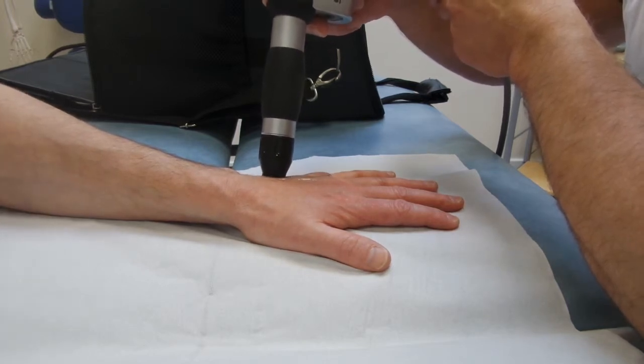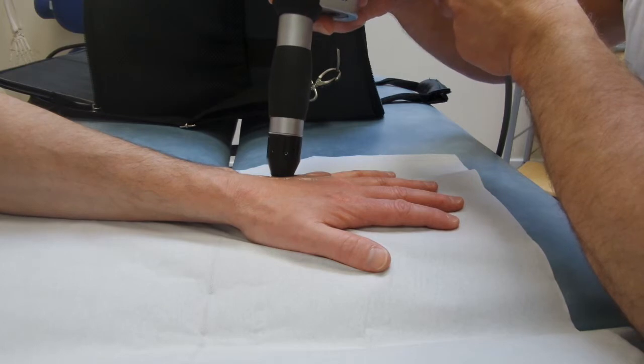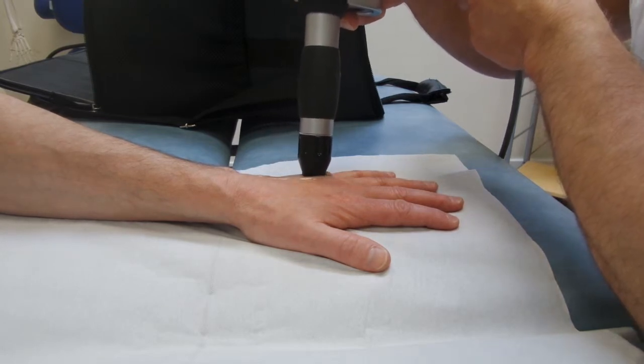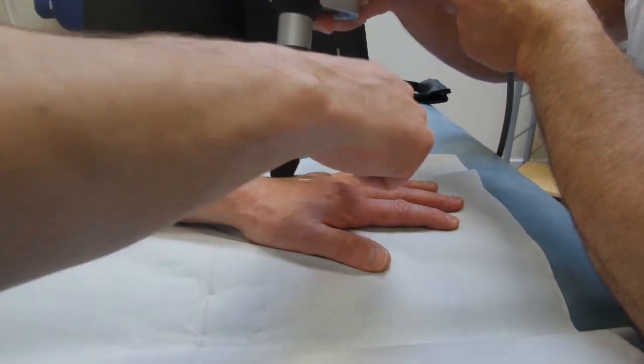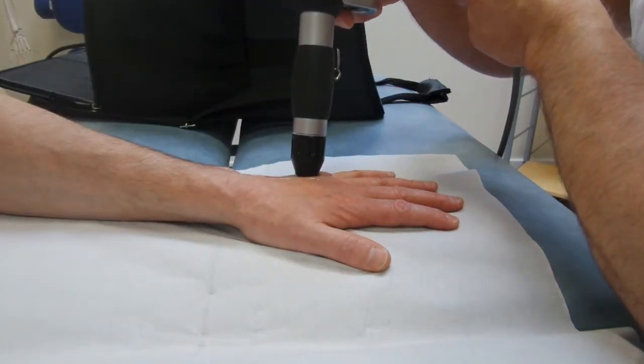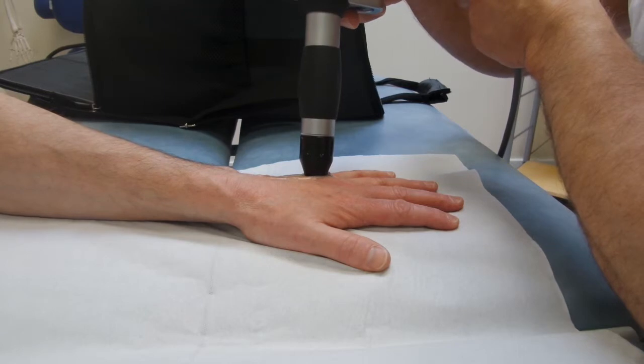The symptoms for this patient have already started changing. The filling of the gutter is disappearing. There is actually a line now in between the two metacarpals, and the scar tissue appears to be going down already.